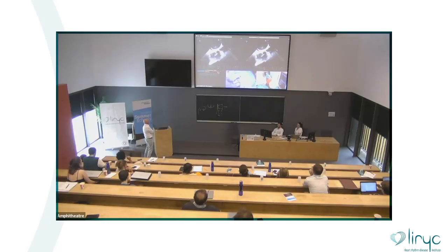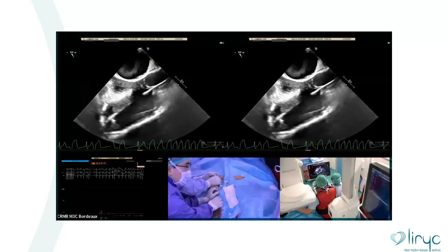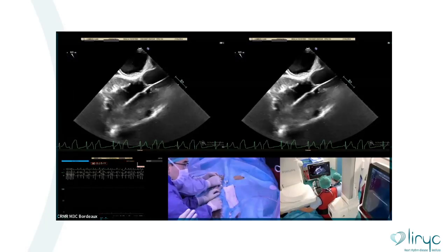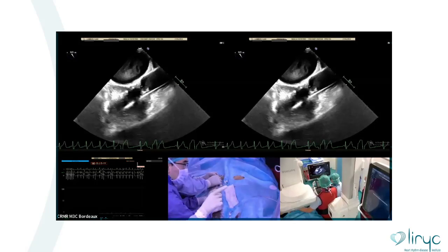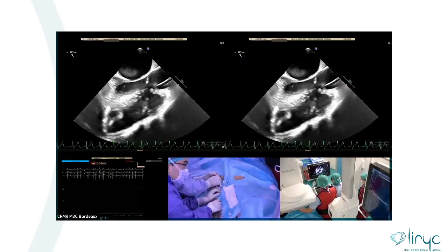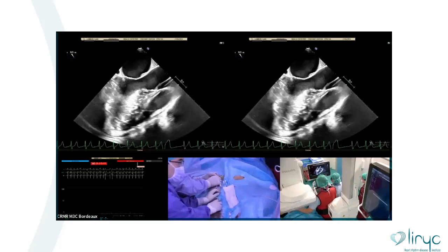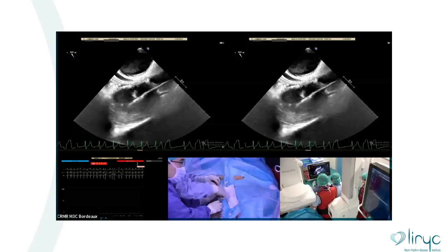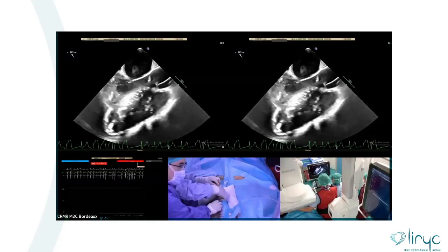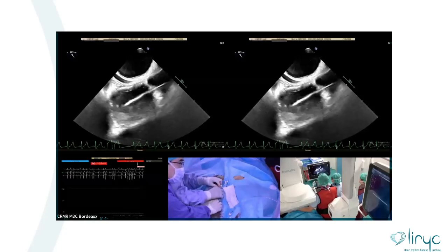You haven't passed. Wait a minute. Let me see. Olivier, can you just try to follow the catheter from the aorta, the long side? Just there, the apex. I want to check, I'm not sure that the sheath passed across the shunt. You haven't crossed. Wait a minute, just there. I want to test whether we have the railway sign. If you can find the railway sign in the right ventricle, it means that it is okay. But if you cannot find it, it means that you haven't passed.